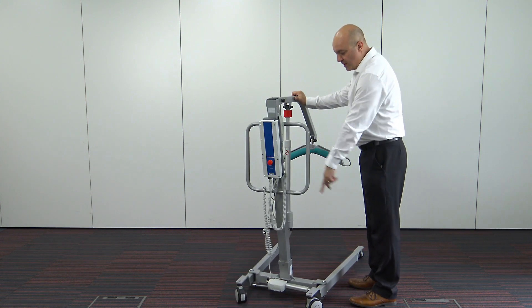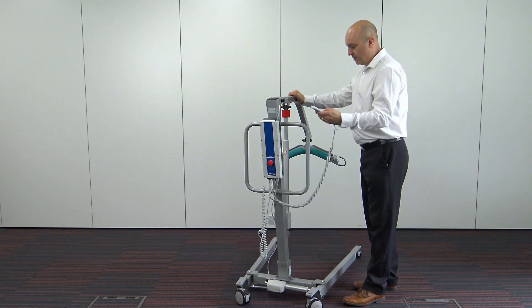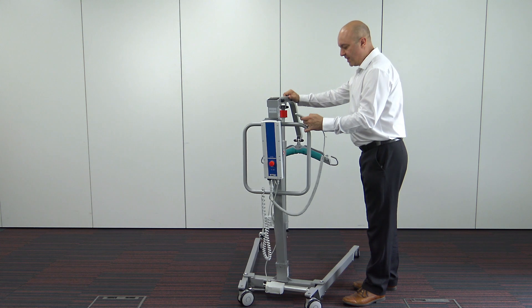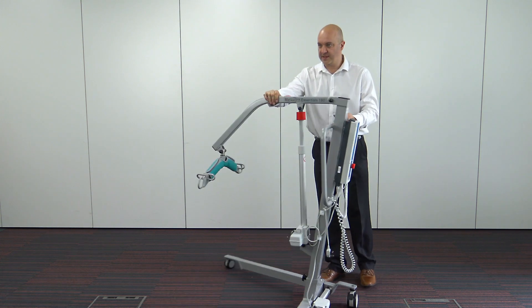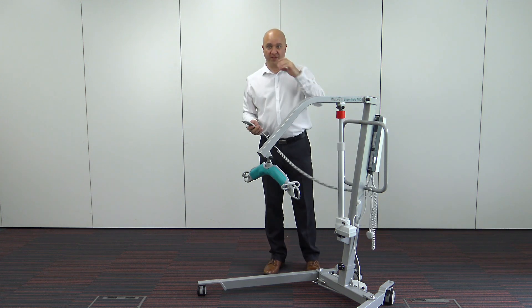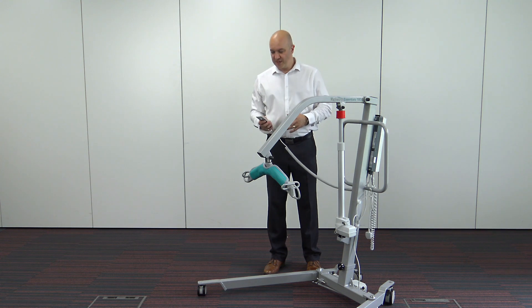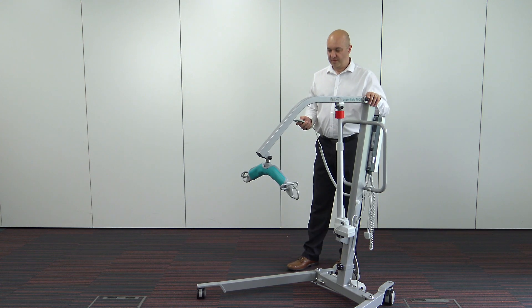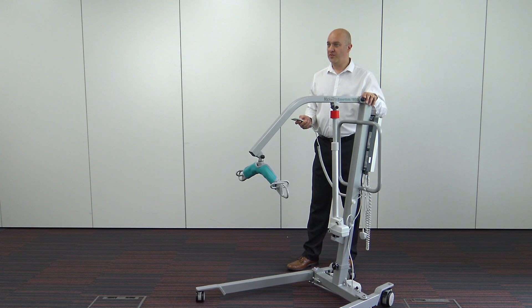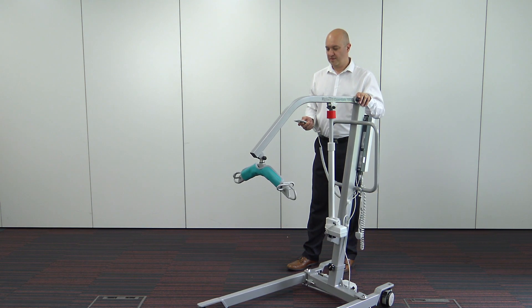The actuator in between those two casters is what operates the leg opening. You'll see the legs get into their widest position — the widest position for the legs is 1176mm wide. When it's in its closed position, it'll be 601mm. All of this technical information you can find on Prism Medical's website, prismmedical.co.uk.